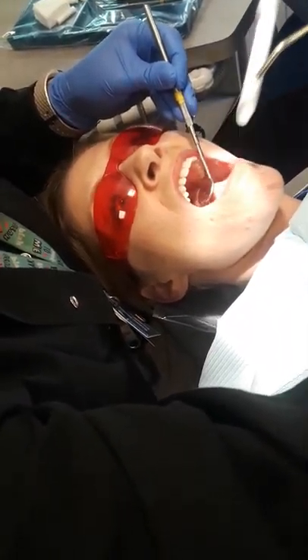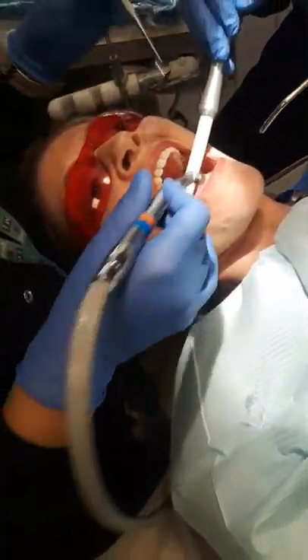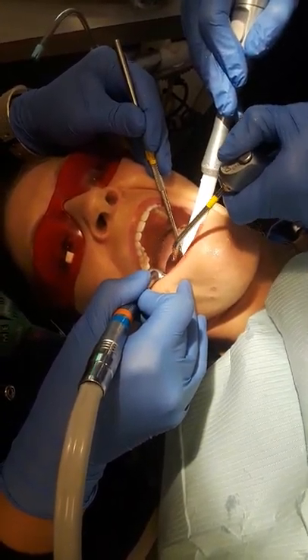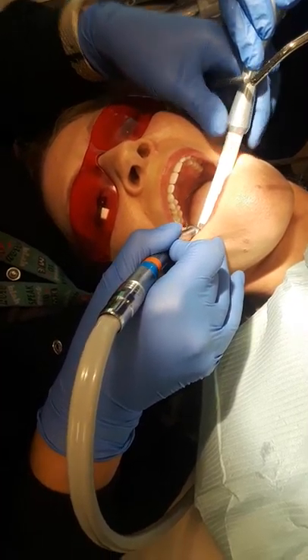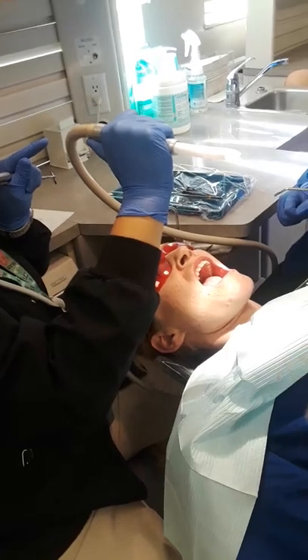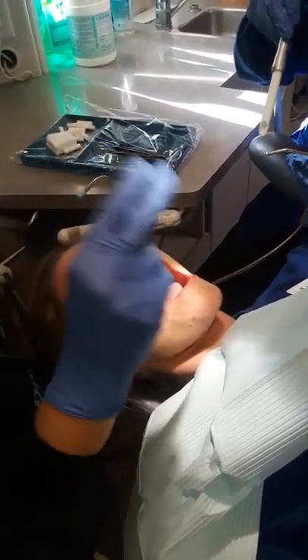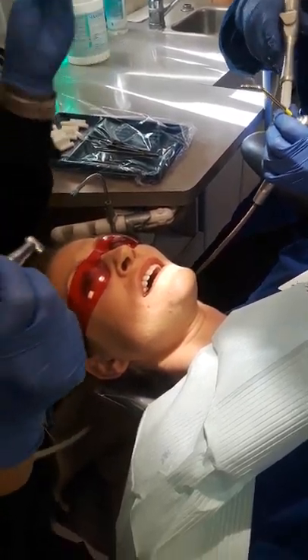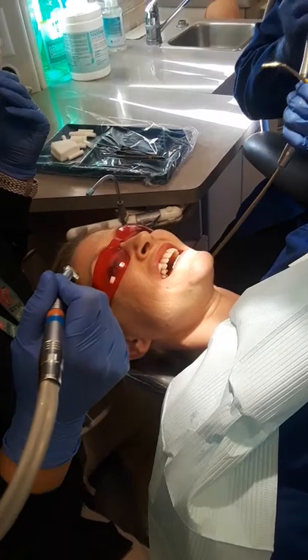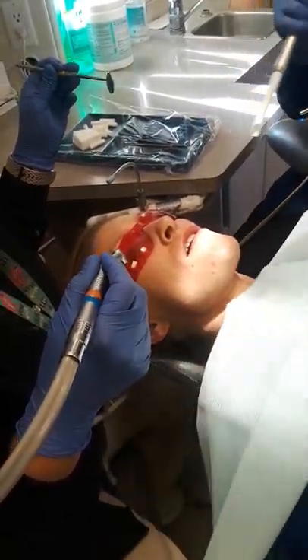Let's practice on moving. Can you just drop a little? I feel claustrophobic. If I'm here, go in because I've got to position myself. If you need to move, you're just going to move here. I don't feel like I have any grip on it. So there are three ways to hold it: if you can't hold it straight like this, you need to grab it like this, or grab it with your thumb up. Your hand keeps moving, so I'm going to get upset as a doctor because every time you move, you're moving me. I can't work until you stay still.